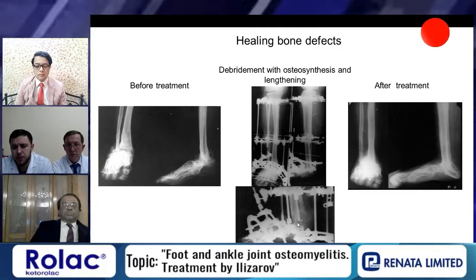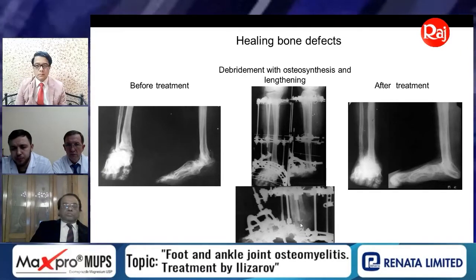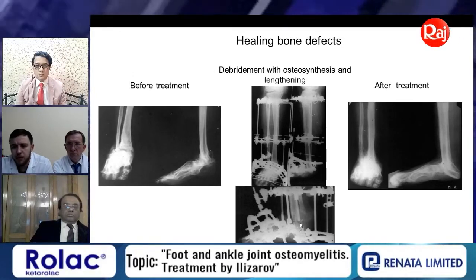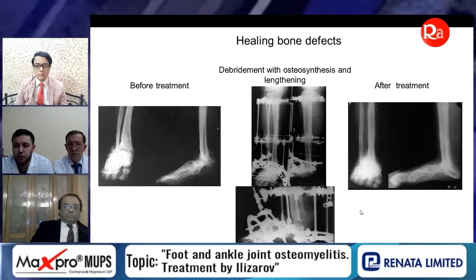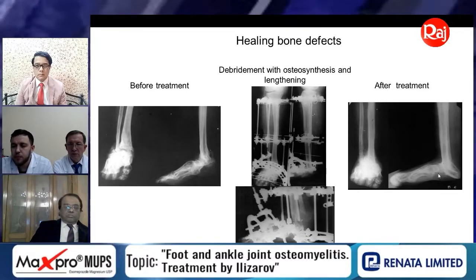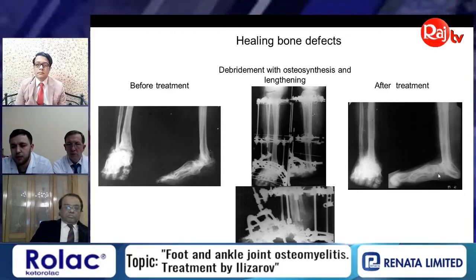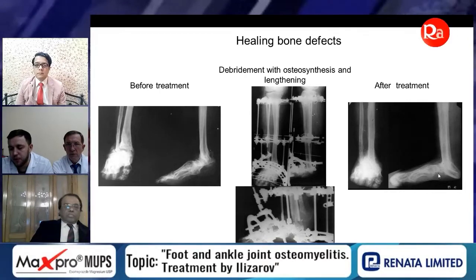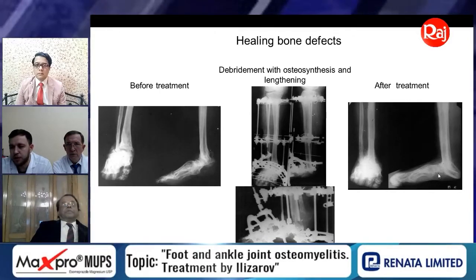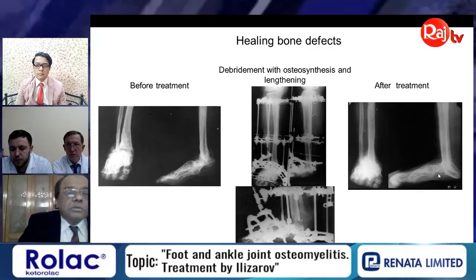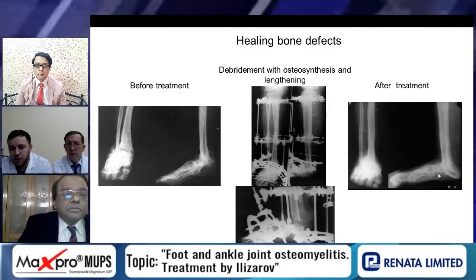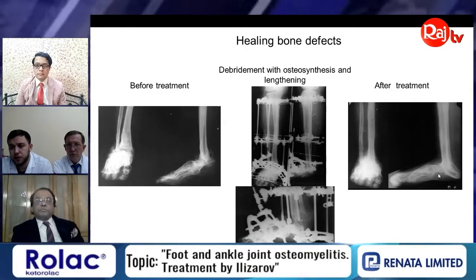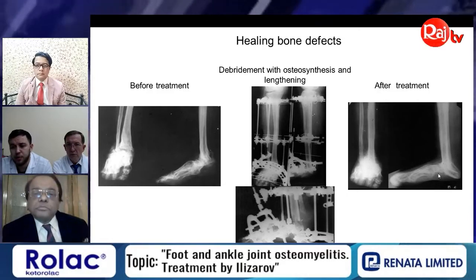After creating enough bone tissue in the hind foot position, we perform a second osteotomy in the distal part of the tibial bone fragment to create a foot arch in the hind foot and good conditions for stabilization of the middle foot and the new hind foot bones, enabling healing and fusion in that position.